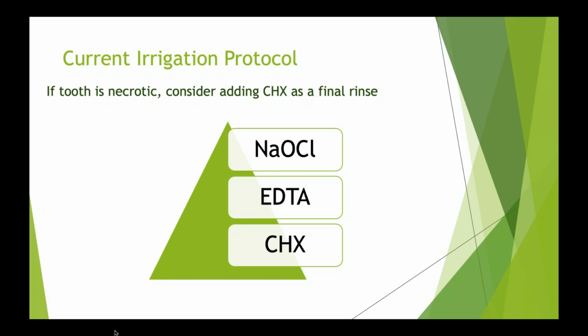reinfecting. But if I go into a tooth that's either been treated and I'm doing a retreatment, or a tooth is necrotic, now I'm dealing with bacteria on the inside of the tooth. And if I go in and do my cleaning and I create the smear layer and I get bacteria that gets caught against the canal wall, I still have to get that bacteria out. Well, I've already just mentioned to you that if I go back in with bleach again after EDTA, because remember, EDTA removes the smear layer, then I can excessively dissolve more of the canal that I don't want to do. So I want dentists to start thinking about chlorhexidine as a final rinse.